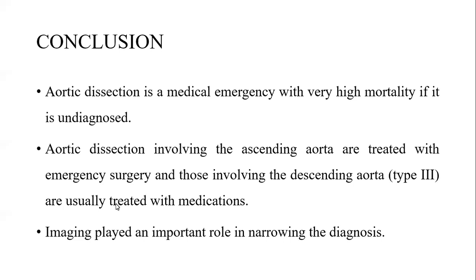With this case, CT confirmed that it was Stanford type A aortic dissection, so the patient just had to go for surgery. So imaging plays an important role in narrowing the diagnosis.